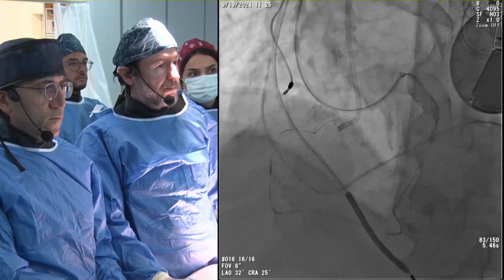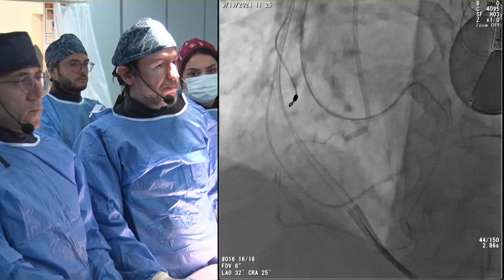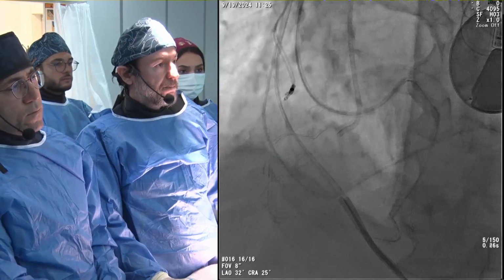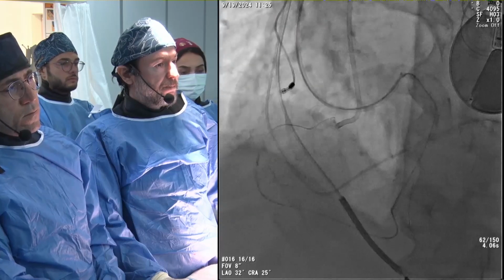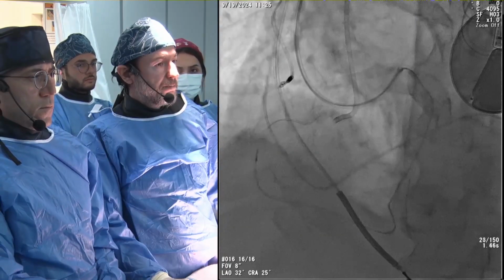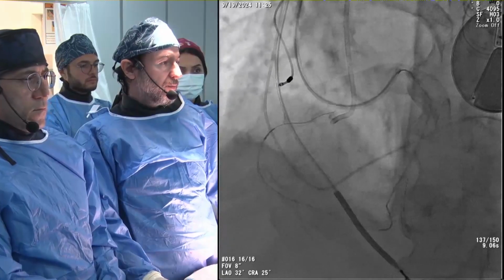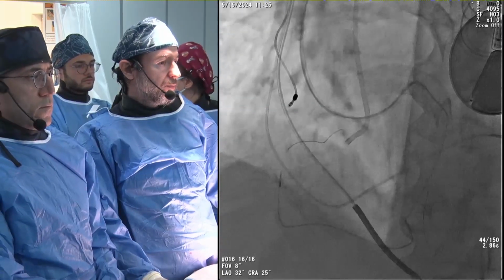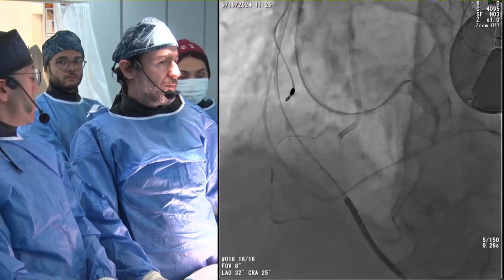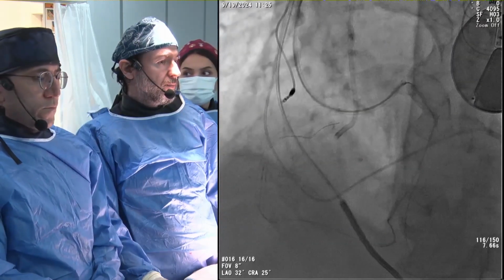But if there is no other way possible, we probably have the knowledge of the E-CART, electrocautery re-entry. Today we have a specialist for E-CART, Dr. Ashwad here. So probably we have all sorts of technical advice, but if there is one advice just for me, probably I would have changed the antegrade system from the femoral, because the radial stabilization is not good. So in terms of 6 French, 7 French, regardless, some kind of push for the reverse CART necessitates the antegrade wiring. And I believe that the femoral approach would provide the best antegrade approach for the ostium. That is one possible advice for me, but I don't know how you take it.